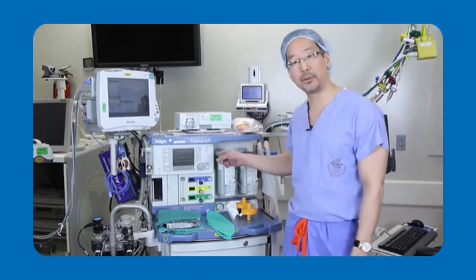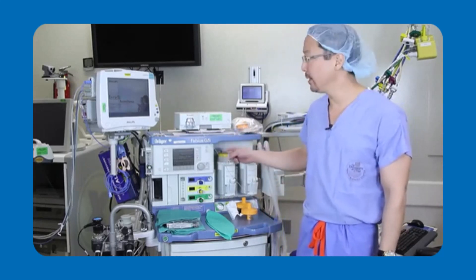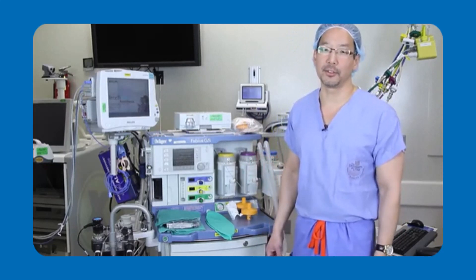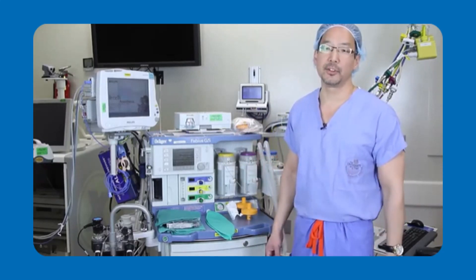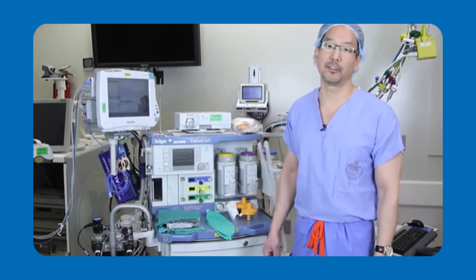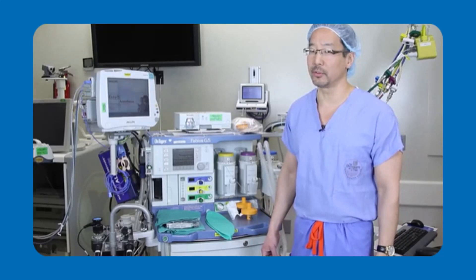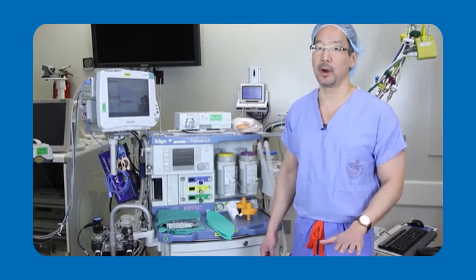It's important to realize that although I'm showing you on a Fabius GS machine today, the principles I'll be teaching you apply to all anesthesia workstations. The issue with newer anesthesia workstations is that they contain a significant amount of elastomeric parts and plastics that make it increasingly more difficult to flush the machine to get below five parts per million.